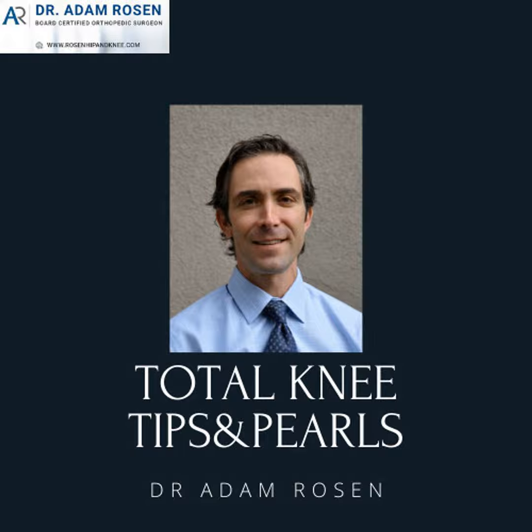At this point, you've essentially exposed most of the bony aspects. Usually there's a large synovial membrane over top of the patellar button with just a little eye peeking out. So you can expose that if you need to and take off what you need. It's rare in my experience to really have to take off the patella. Usually you know if it's loose. And if it's significantly worn, you may take it off. Obviously, you're going to remove it if you're dealing with an infection.